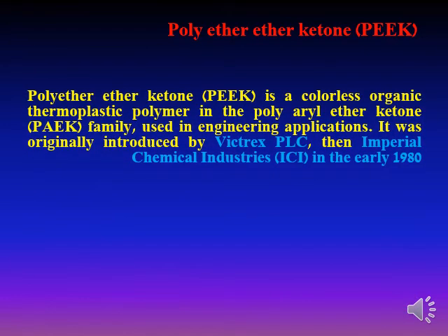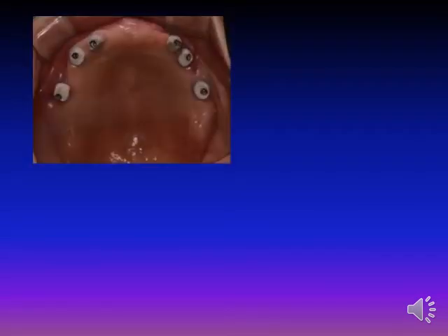And we can use polyetheretherketone (PEEK) as the telescopic denture, and also we can use chrome cobalt material. And we can use other materials.